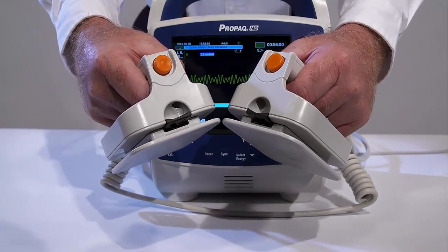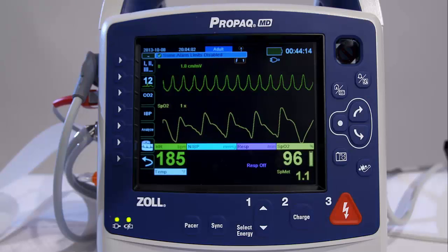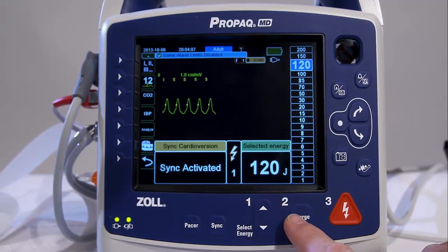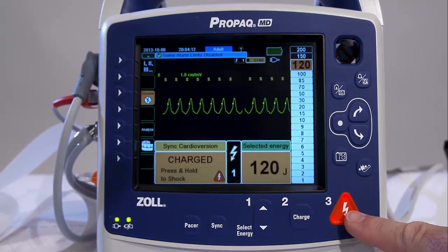If additional counter shocks are needed, press the Sync Quick Access key again, readjust the energy settings, charge the unit, and deliver the shock. The ProPak can be configured to remain in Sync mode after cardioversion.